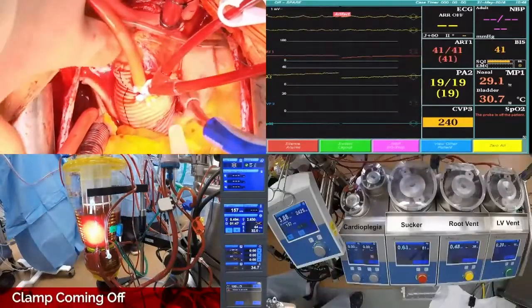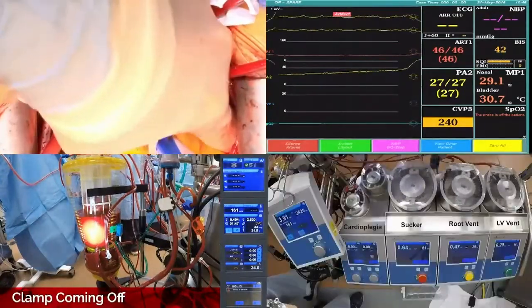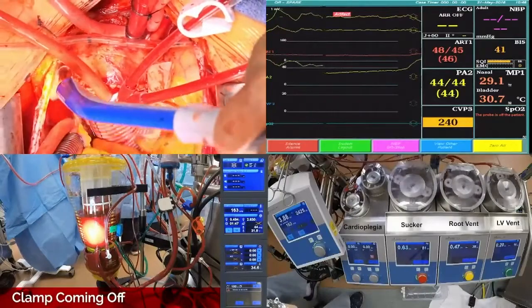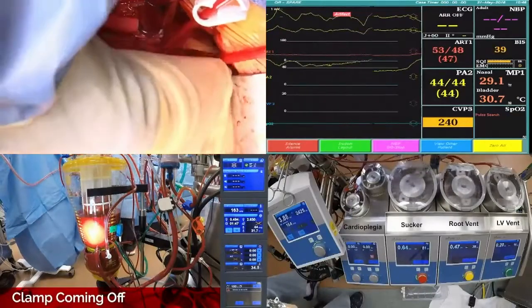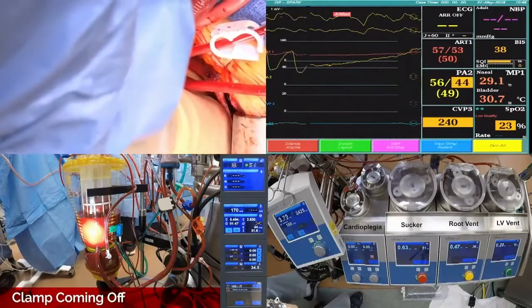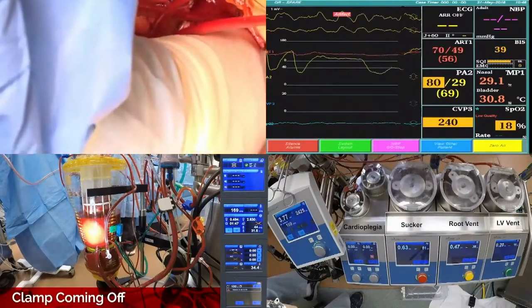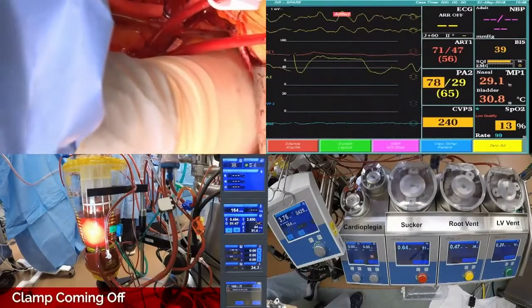And then I believe we do come off pump, and that's when you decide to go back on. Right. So place it. Essentially, the suture line is hemostatic. I really try to fix everything with the heart clamped, or at the very least on pump. It's just a lot easier. Of course, in these aneurysms, the suture lines bleed until you get protamine, typically, from a needle hole standpoint.